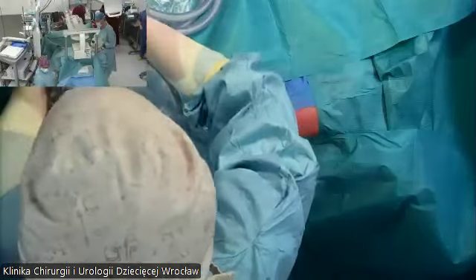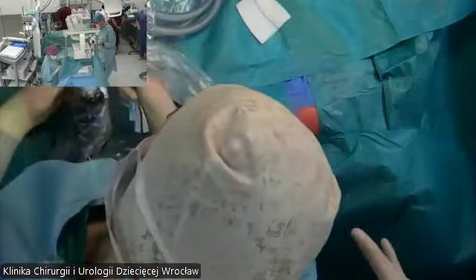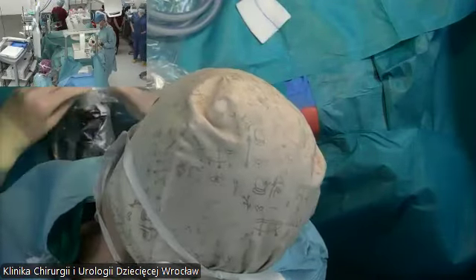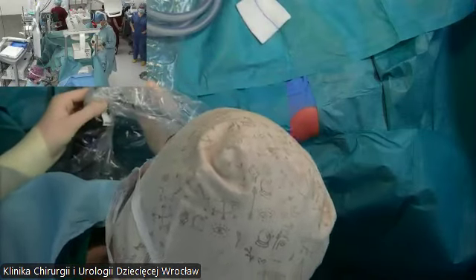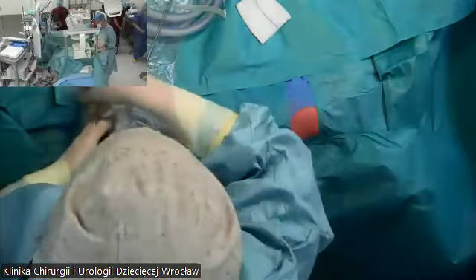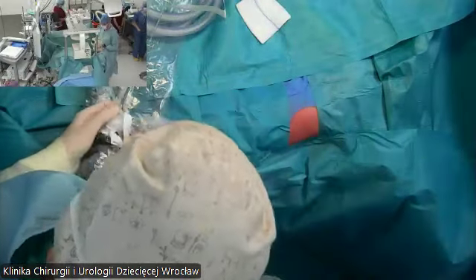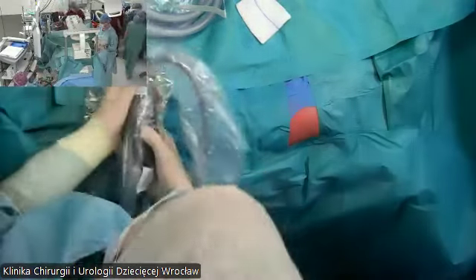Carina, above the carina. So this is what, of course, we have the experience with such small babies. And my first intention was to do the whole surgery today. But because the baby is not very stable, we will limit our procedure only to close the fistula. The next stage we will do a few days later.